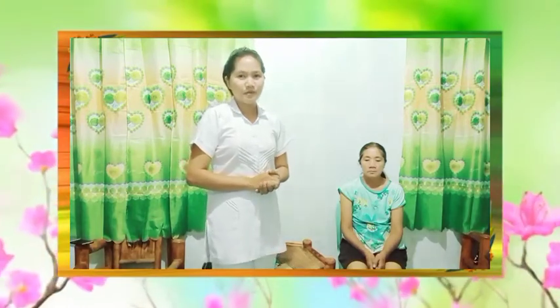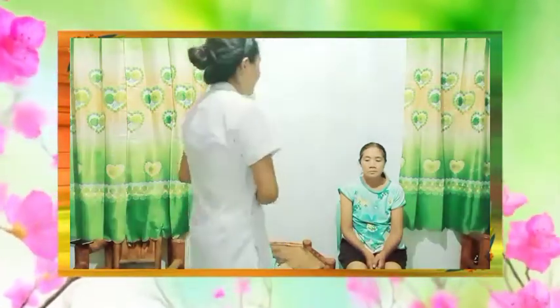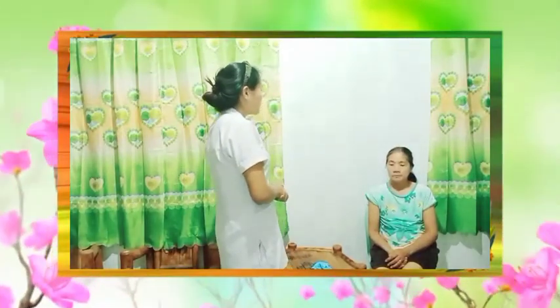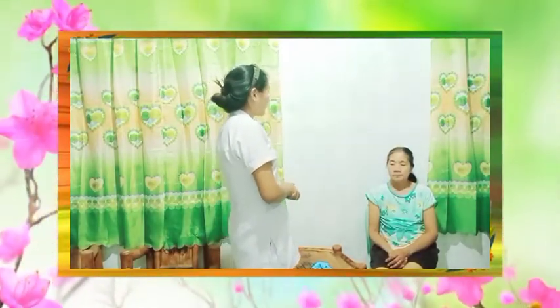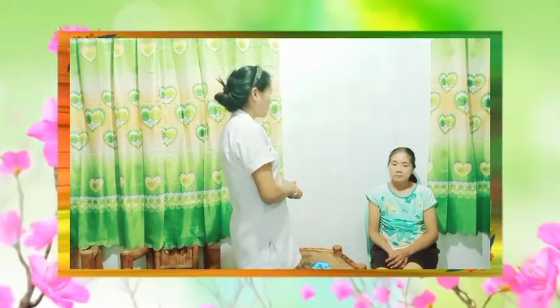After identifying the patient using the two identifiers, we need to explain to the patient what procedures we're going to do. So ngayon ma'am, ito-check naman po natin ang inyong tenga at ang inyong panlinipo.